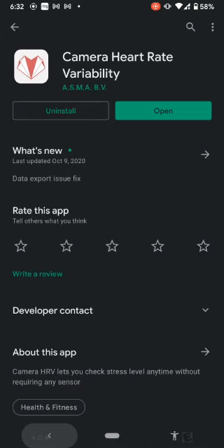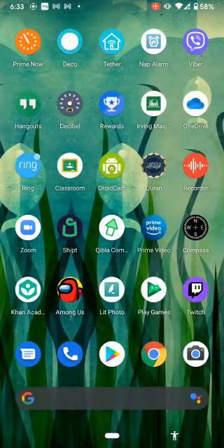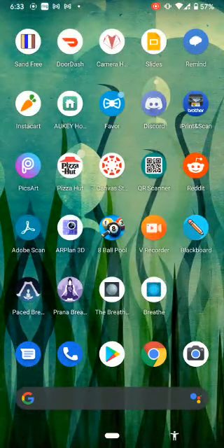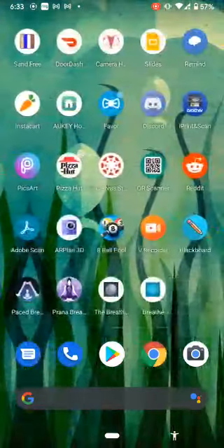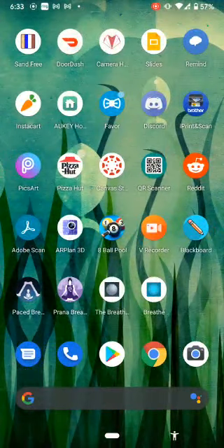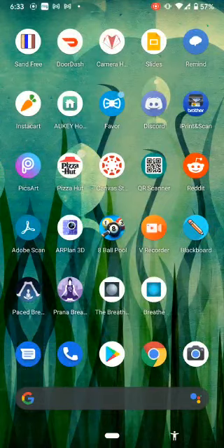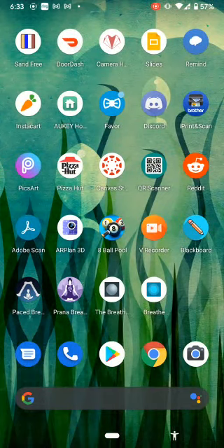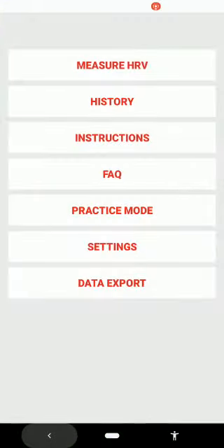Once you click Install, the app should come up on your phone. Go back to the home screen to find the Camera HRV app — it's that same icon with the red heart and white background. Click on it to open the main menu. Before getting started, click the Settings button, which is the second from the bottom.